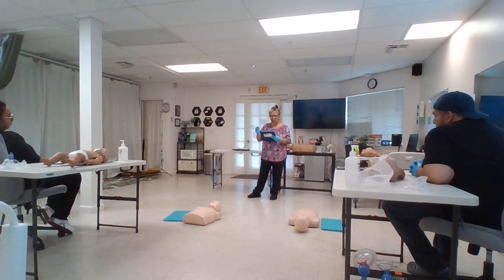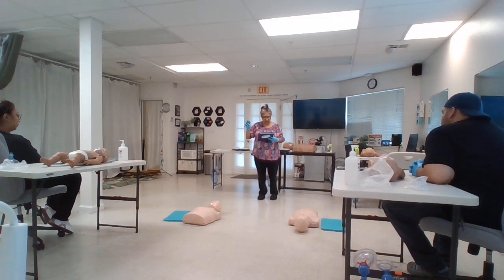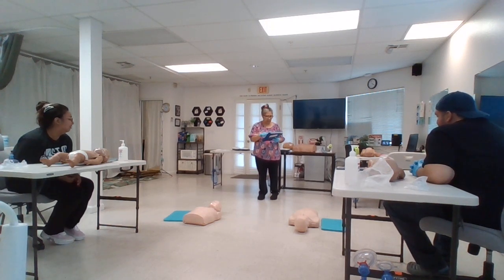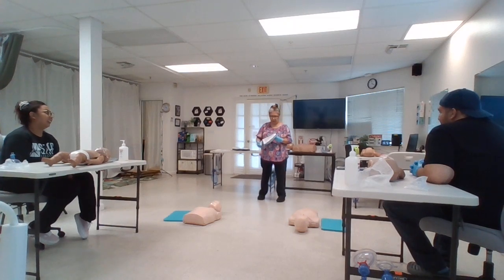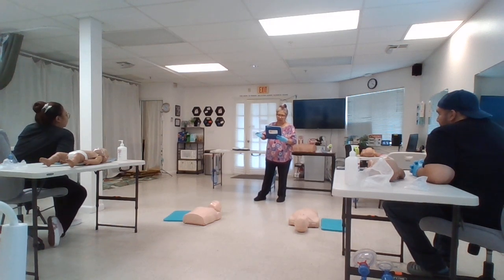On checking the scene, it's already been decided that you already checked the scene. So you'll be performing a total of 3 cycles of CPR. Oh no, just 2 cycles. I'm sorry, 2 cycles of CPR, and then after that, I'll be using the AED.